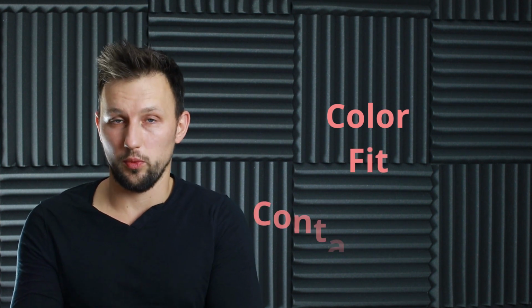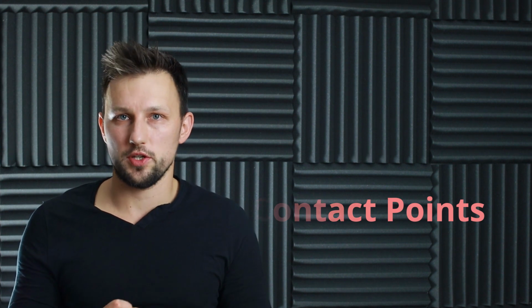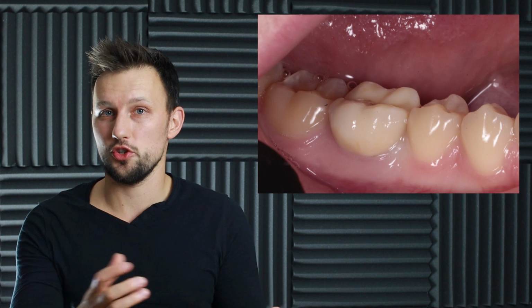For sure we have to judge whether the color of the crown is okay, whether the fit is okay, whether the contact points are okay. But there is a question: how do you exactly know that after you try the crown, it's in the right position? How can you judge it?